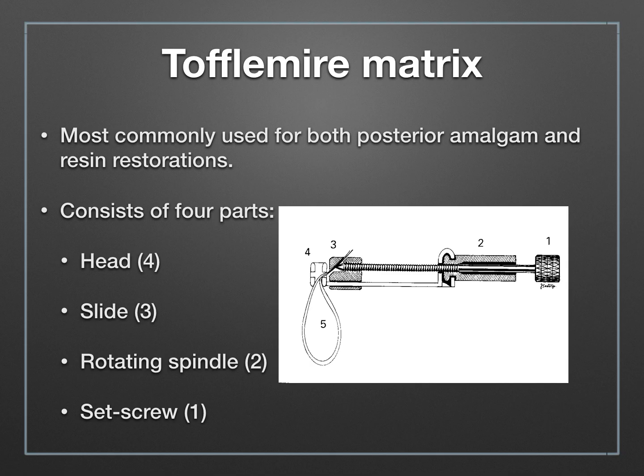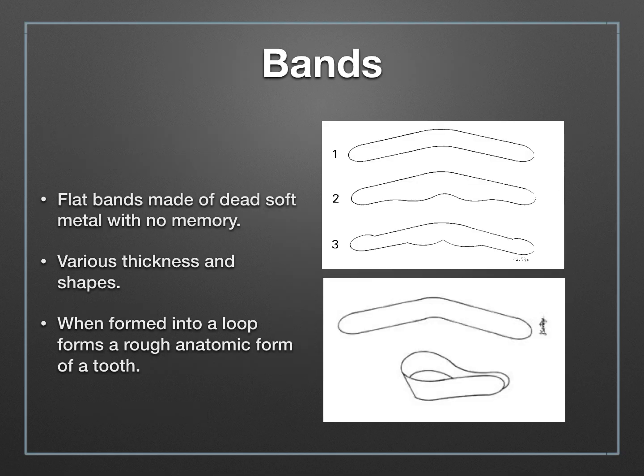The Toffelmire consists of four parts: a head, which is where you insert the matrix band; a slide; a rotating spindle; and a set screw. Each one of these parts is important in the function of your matrix, so we will visit them all closely.